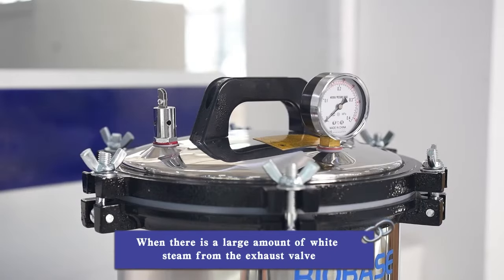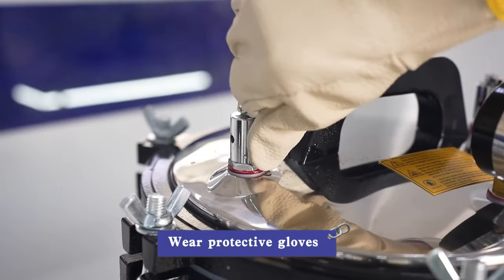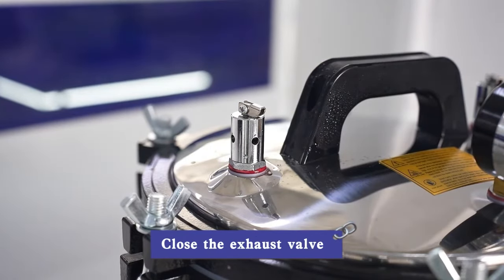When there is a large amount of white steam from the exhaust valve, wear protective gloves and close the exhaust valve.